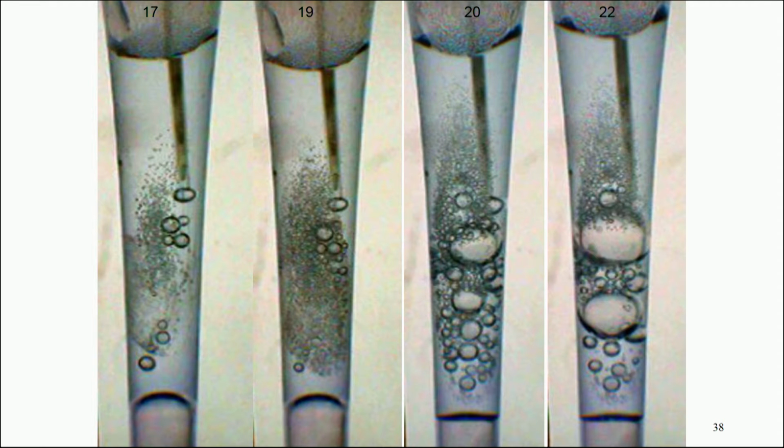What we found is when you put the diode laser tip in and you start to agitate the fluid, what you're seeing here are a few frames we've selected from some high-speed photography that we did in teeth that were clear, so you could see into the action here. You can see these formations of these little micro bubbles and these macro bubbles that then collapse to give you these little tiny micro bubbles.